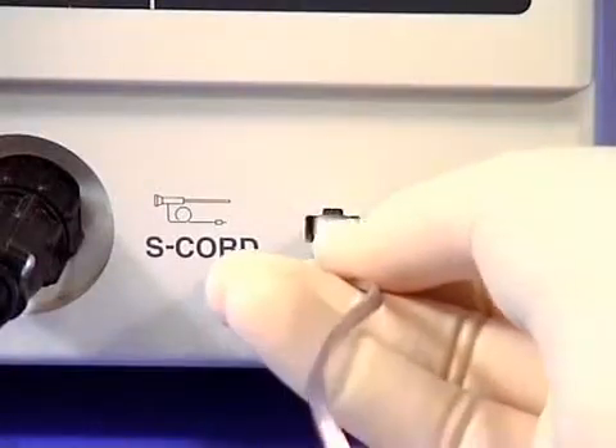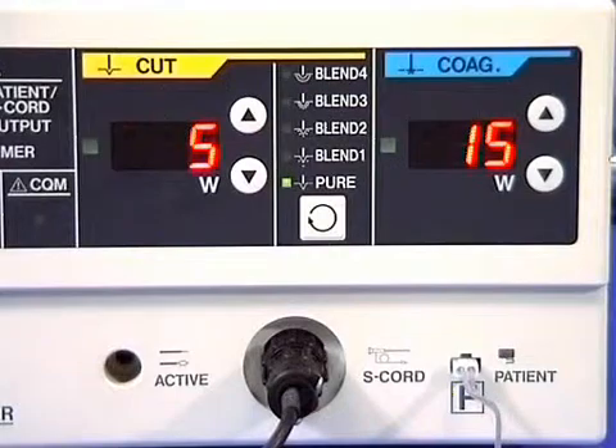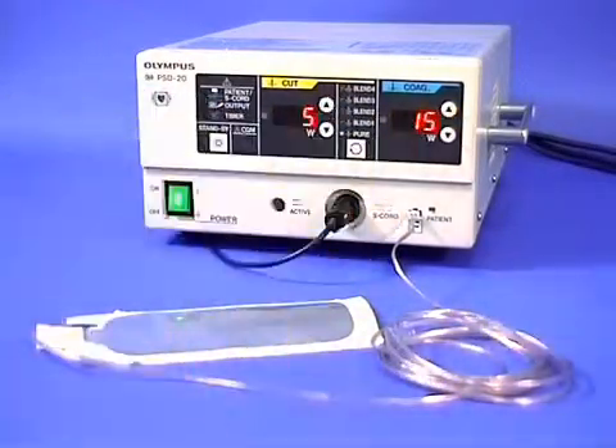Electric shock can never occur. Although most units have a choice of cut, coagulation, and blend current outputs, most experts use a low setting of coag current to give the slow cook effect, which is best for safe colonoscopic polypectomy without bleeding.